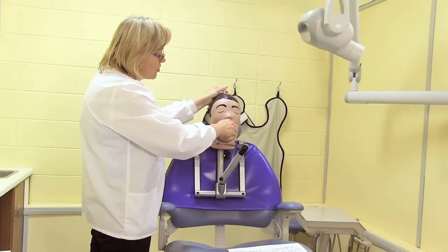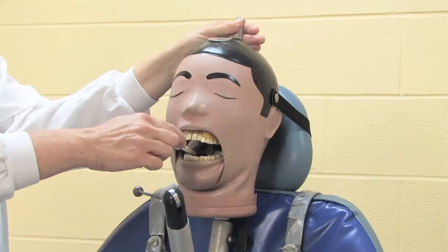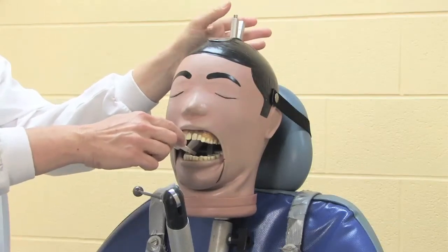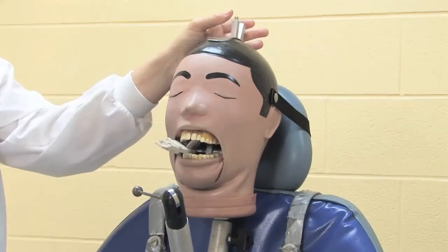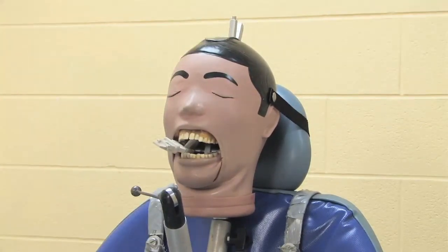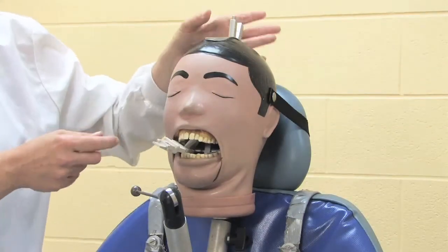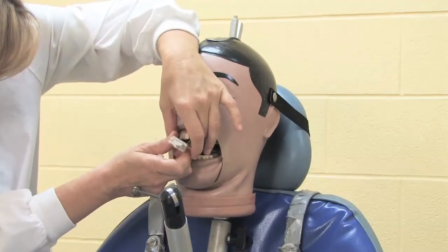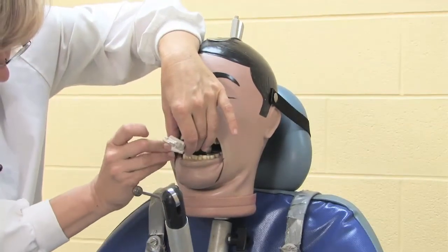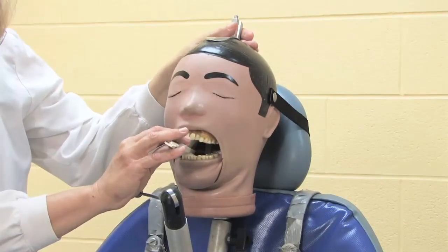Now for the premolar shot, we always remember our landmark, and in this case our landmark is the distal of the canine. What I will do with the film is move it slightly to the mesial to ensure that the seam is more towards the mesial, to ensure that the distal of the canine is in the shot, because the seam does not have the actual film in that area. In this case, my worry is the bending of the film, so I try to flatten the film as much as possible, keeping my landmark in place.